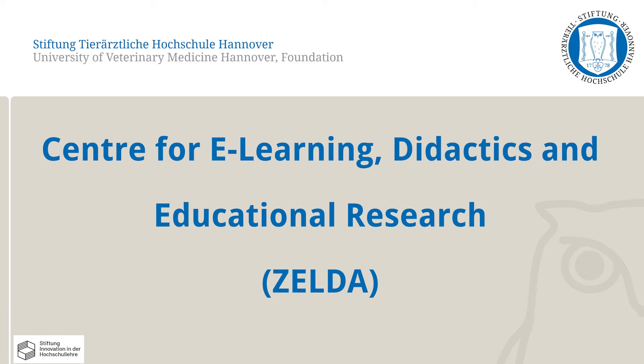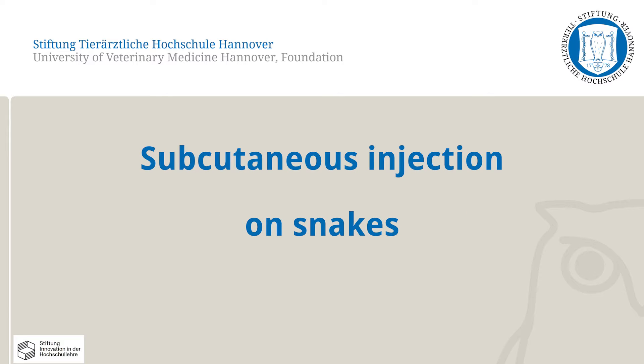In this video, the Centre for E-Learning, Didactics and Educational Research at the University of Veterinary Medicine, Hanover, will demonstrate how to carry out the subcutaneous injection in snakes. Only one of the correct methods to perform this skill is shown here.